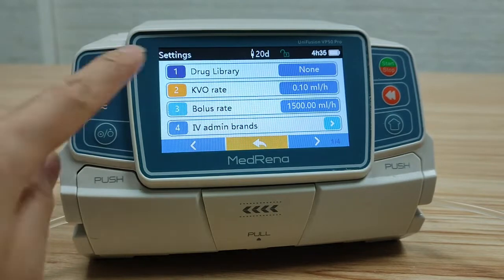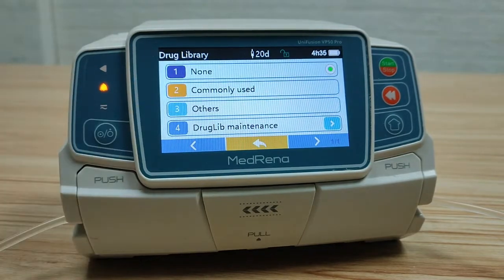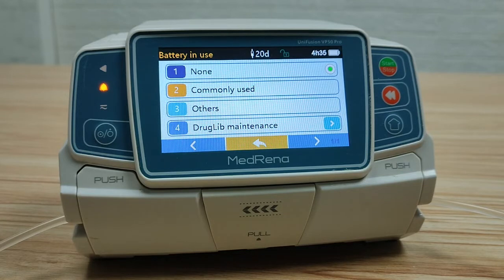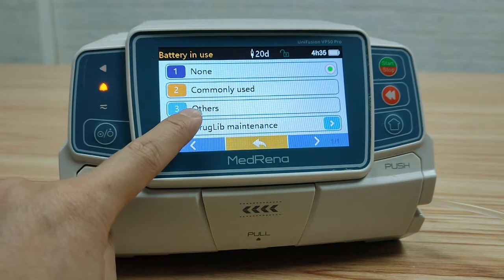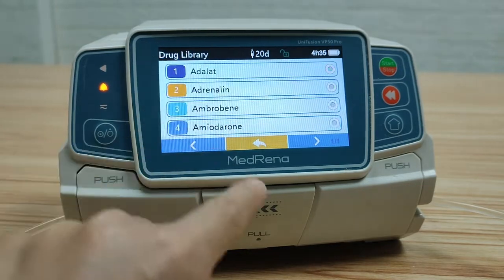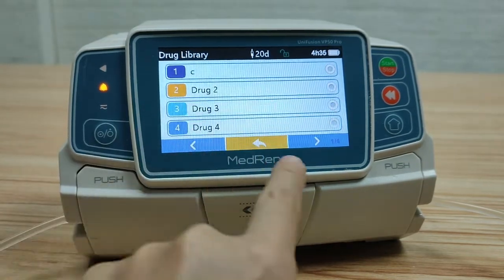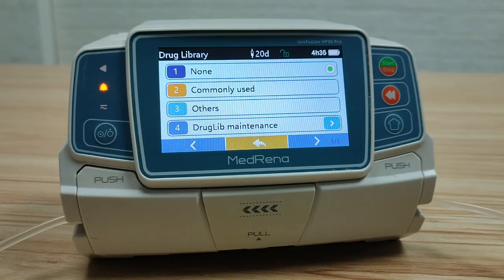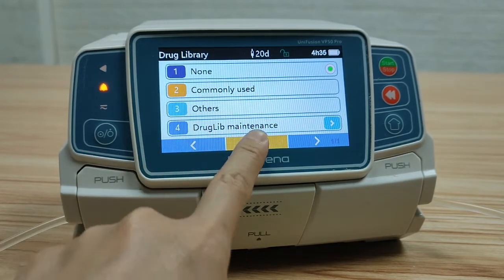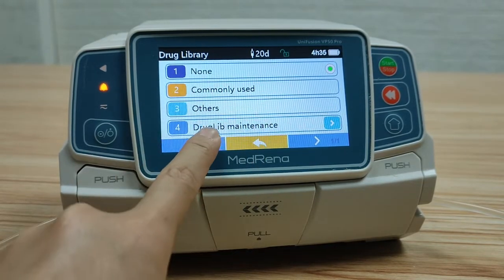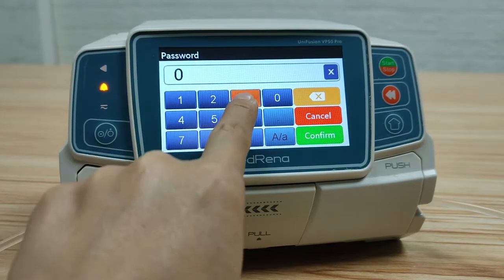First, drug library. This model can store more than 2000 drugs in the system. The drug information can be found in commonly used and others. To edit the drug library, select drug library maintenance and enter the password.